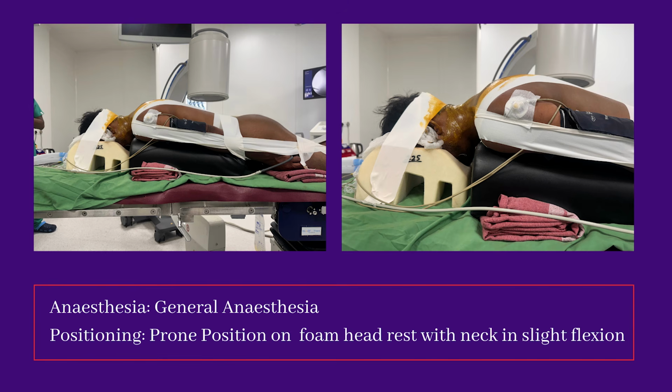This surgery was done under general anesthesia. The patient was given prone position on the soft headrest. So you have to pull the shoulders down to get the unobstructed view of C6-C7 level. So you can see here I have given slight flexion to the neck, not too much, but there is a slight flexion given.